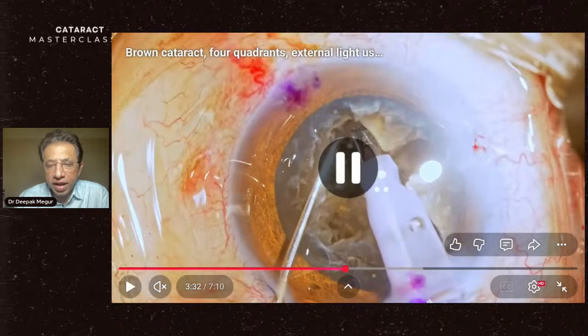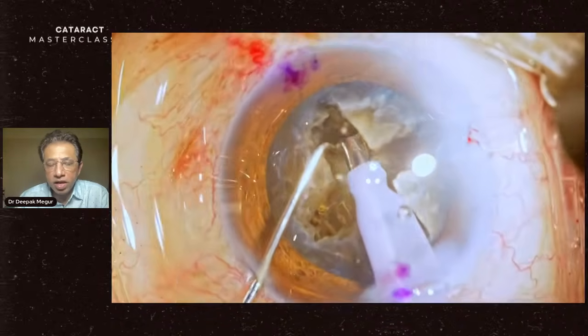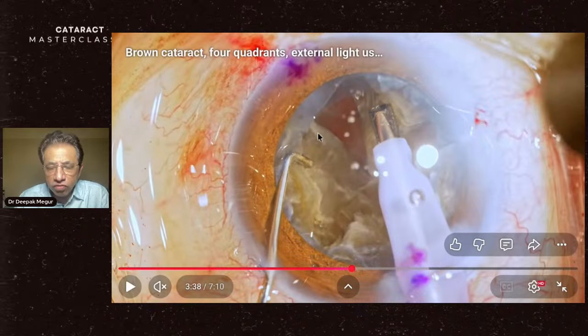So it is not going to crack in a single moment, and we are going to make multiple lateral separation maneuvers. So now let me pause again here. This part of the posterior plate is cracked, but you know what? The central small 1 millimeter hinge, or maybe 0.5 millimeter hinge, is still attached here, and this is probably the thickest part of the posterior plate.